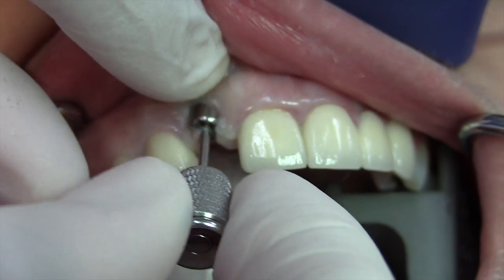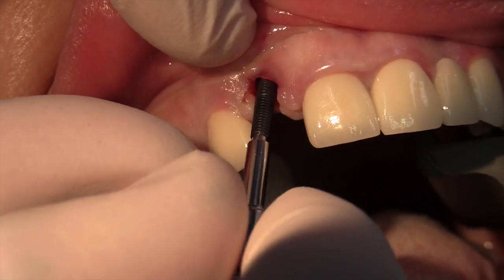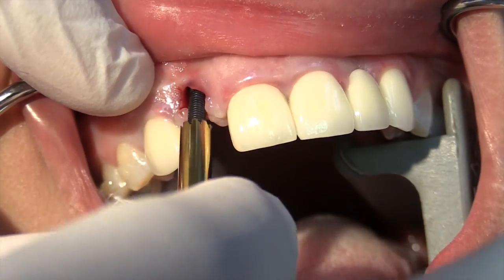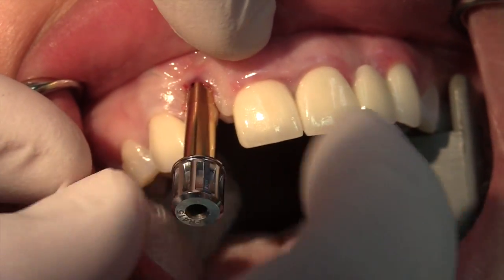For this technique, I will first remove the temporary cap from the implant. Next, I'll place an appropriate size screw in the implant and tighten it to a specific torque or force. Then I place another component on the pin and rotate it until it reaches the implant and tightens in place.